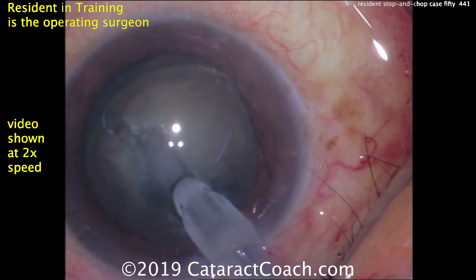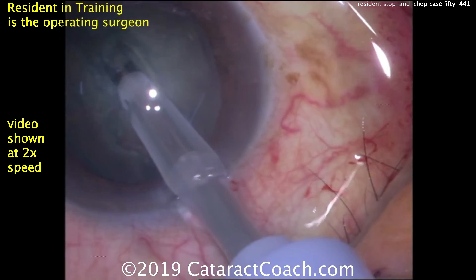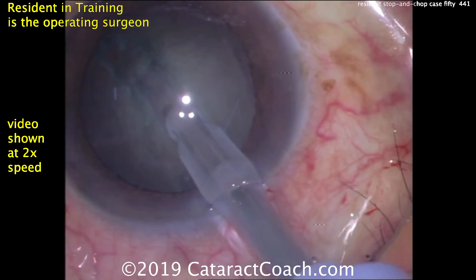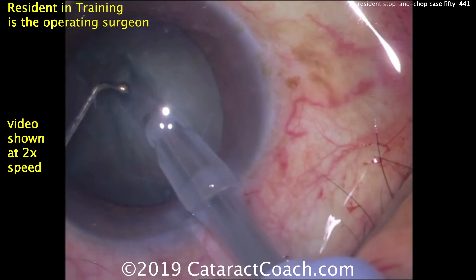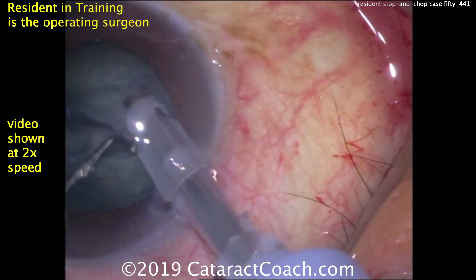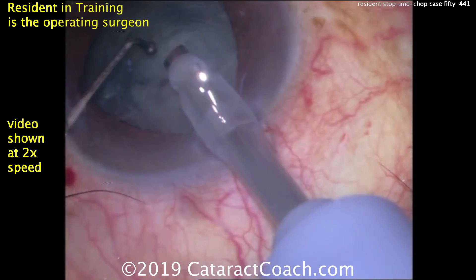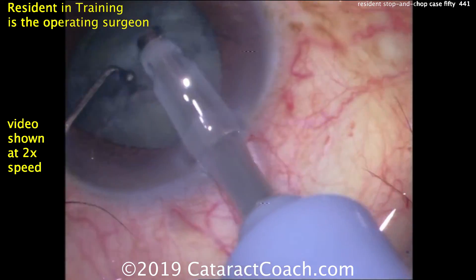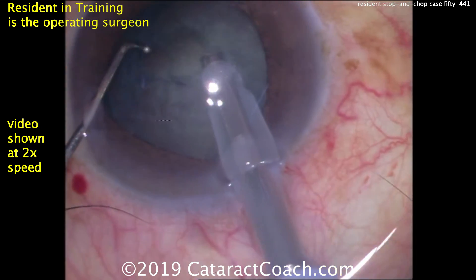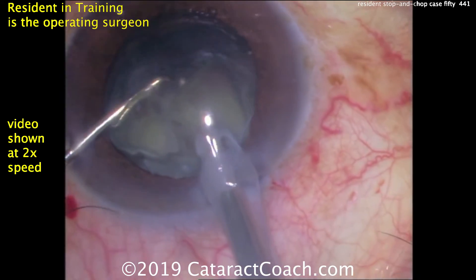Making a good groove — how deep do you make it? Some people judge by the width of the phaco tip: one and a half phaco tip widths is about what they're aiming for. Some people do it by the red reflex. This surgeon is using a ball-tipped instrument in the other hand, getting a good separation. Then buzzing in with a higher vacuum setting, getting the chopper around the nucleus and breaking off a little piece — that looks great, that's a nice chop.